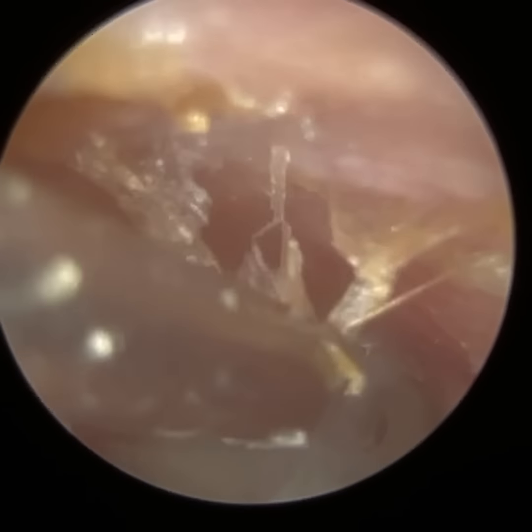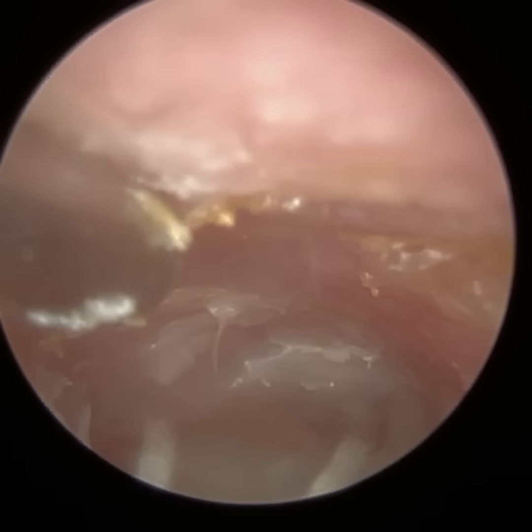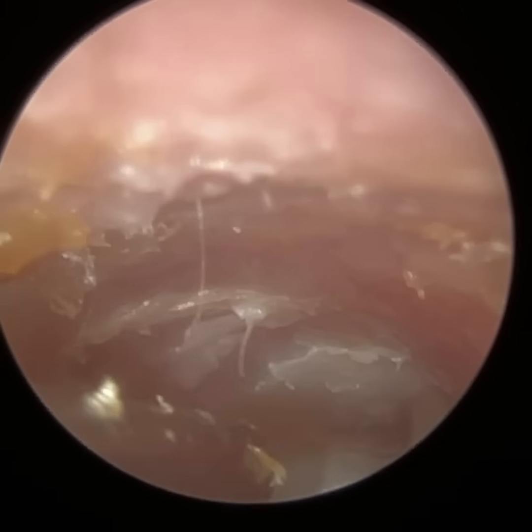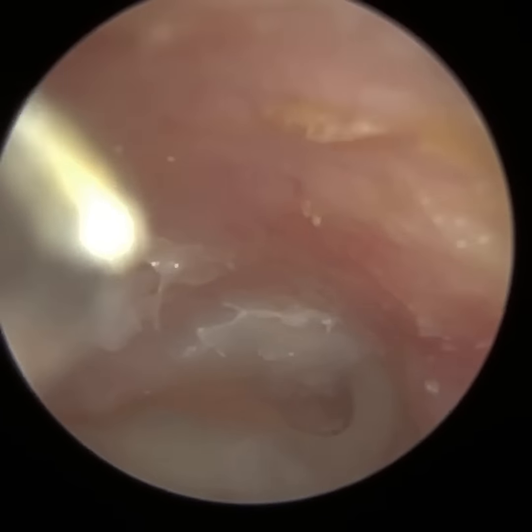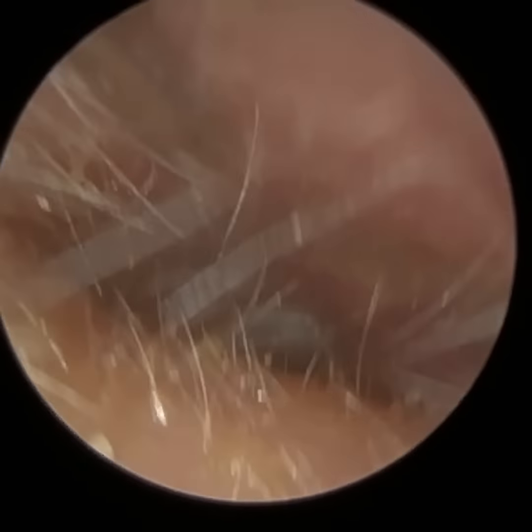So there's one layer missing, and sometimes calling it monomeric, I find it a bit confusing, but you call the healed eardrum, although it has 2 layers, monomeric, and it's essentially because one layer has failed to reheal. So we're just going to be careful there.